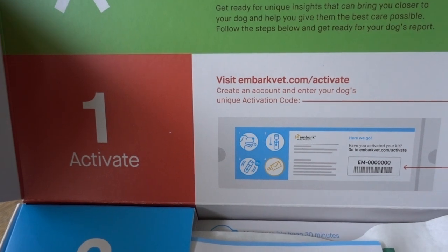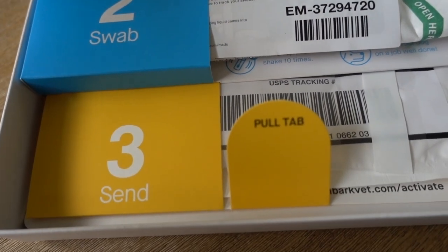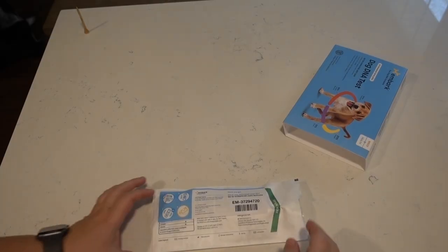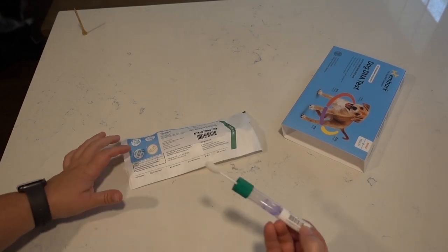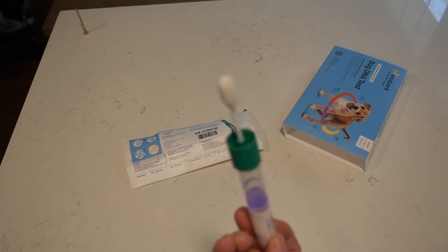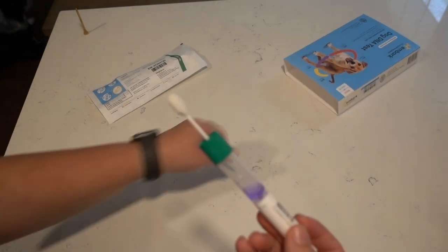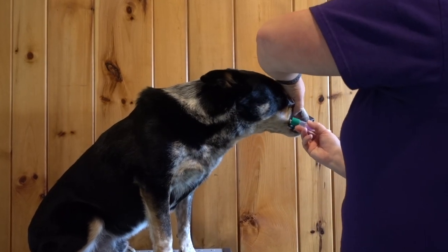Step two is to swab your dog's lower cheek pouches. Before you take that little swab out of the package, make sure that your dog hasn't been eating for at least 30 minutes, and it might be a good idea for them to have had a drink first too, just to make sure they've cleared their mouth of any particles that might affect the results. Note there is no cap on the swab when you take it out, so only take it out right before you're ready to start swabbing.